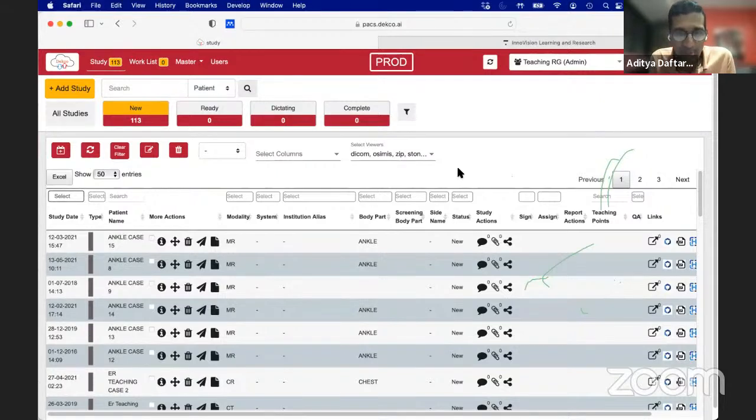Best apps on PC and mobile for MRI. I'm not sure what you mean specifically. If you're talking about looking at images, then you can get paid versions of Osirix and Horos for your iOS stuff.